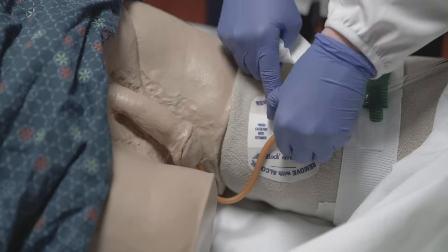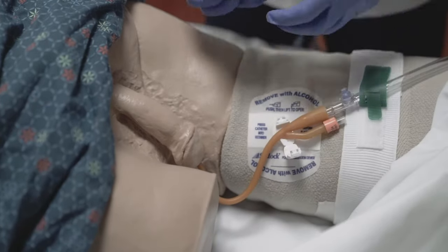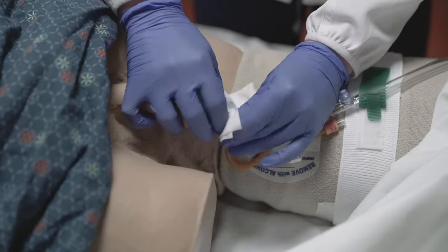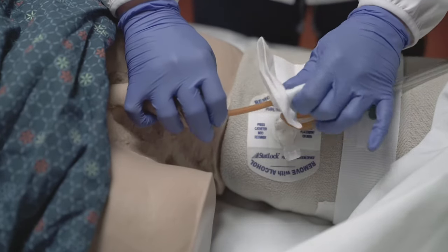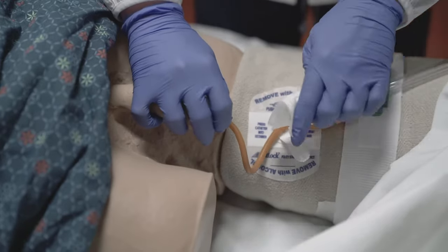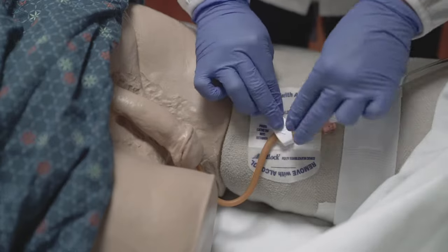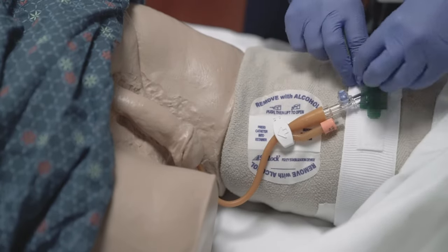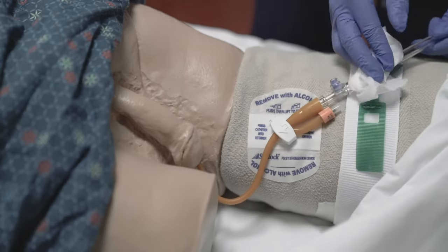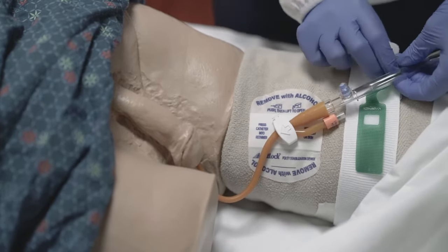Make sure to always clean away from the tip of the penis. Clean the catheter tubing starting at the tip of the penis and working away and down the tubing. Begin by cleaning around the tip of the penis, working back and away from the opening. Next, be sure to clean around the thighs, scrotum, and down the tubing all the way to the bag. This is because it helps keep bacteria from getting into the urethra and bladder.